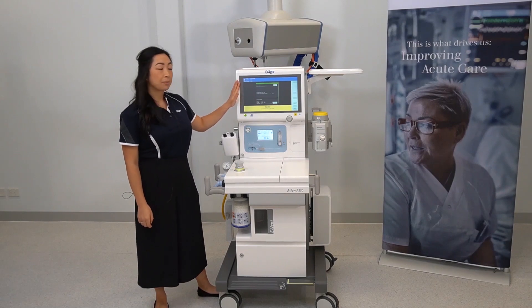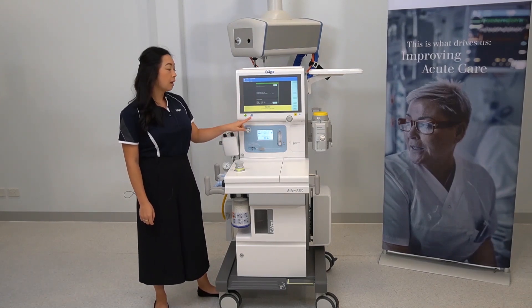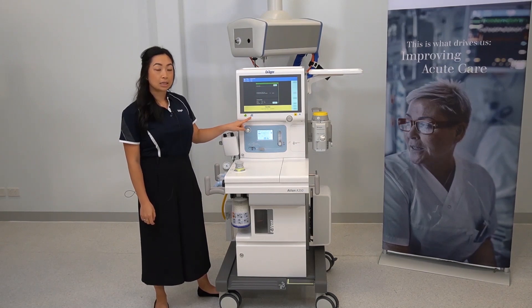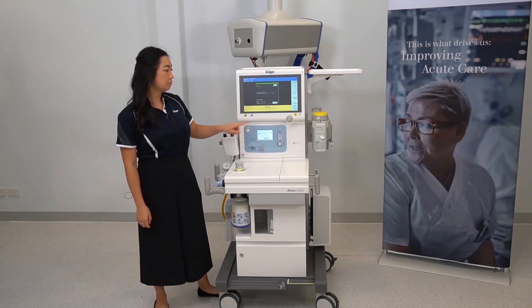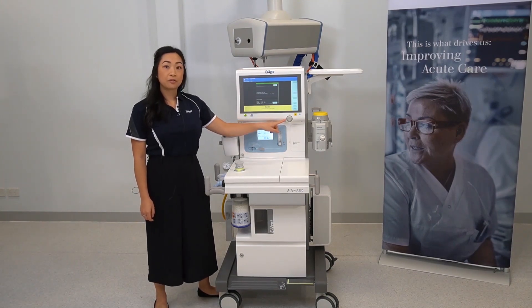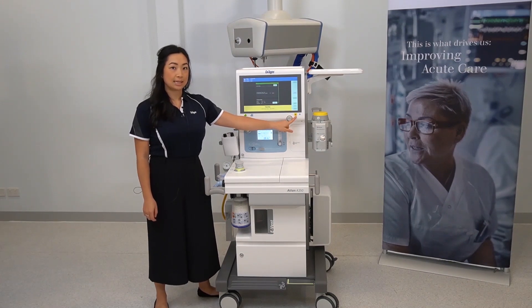This is your main screen, the on/off button, the light button to illuminate the workspace which has three different settings, the rotary knobs for making and confirming selections, and the alarm silence key.